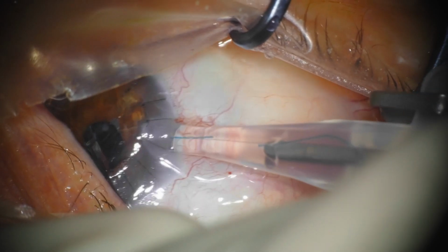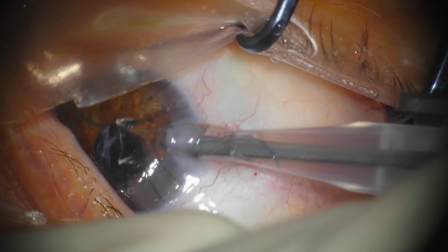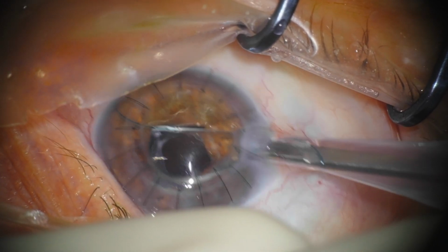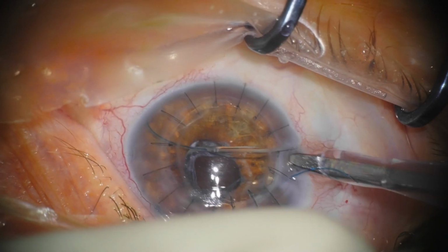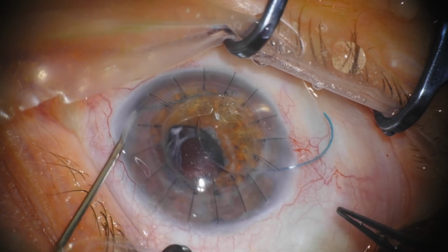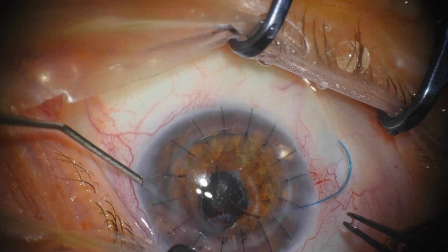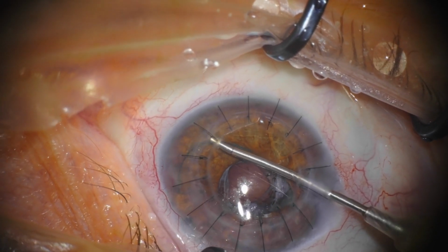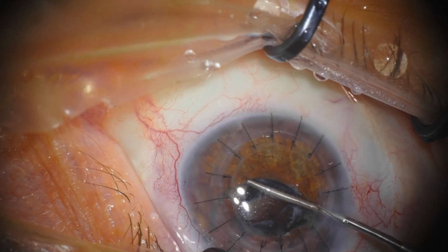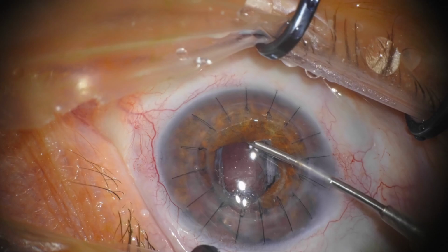So we're looking for a place to create our 2.4 millimeter incision, and we inadvertently cut one of the sutures from the PK. And this is safe because this surgery has been done at least 3 months ago, I believe, and one loose suture or one cut suture will not make a difference. So we can always replace it if we feel the need to.